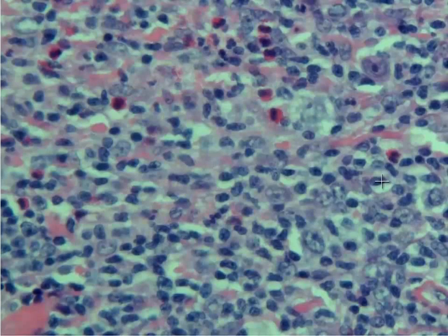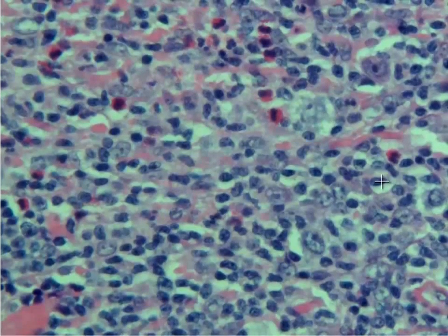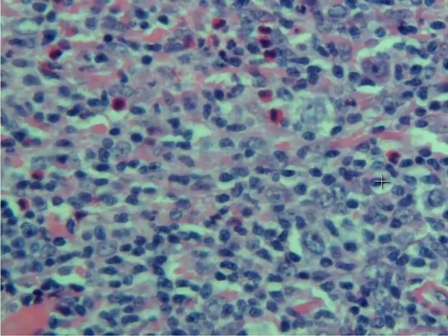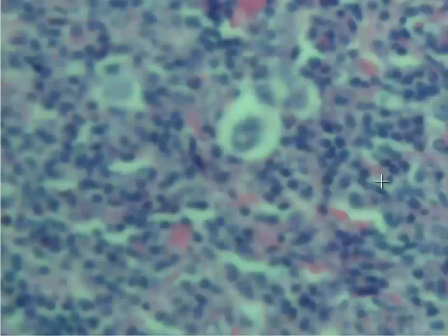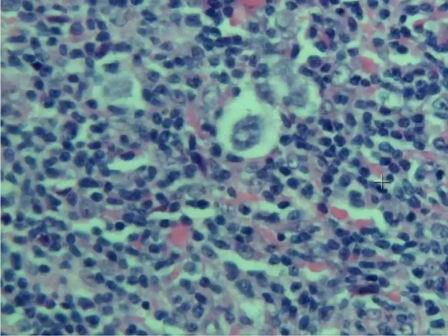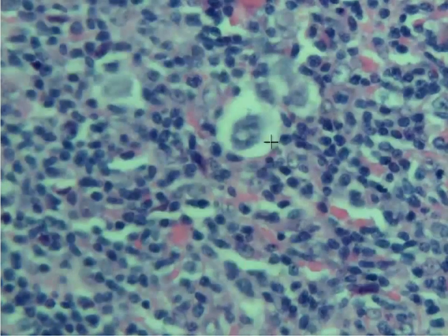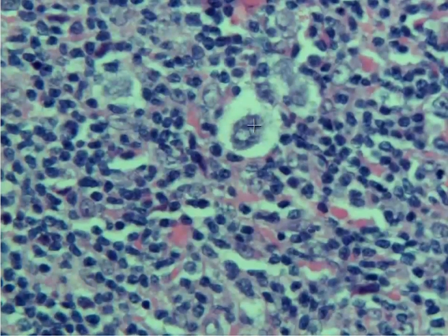Normally Reed-Sternberg cells have either two nuclei or more than one nucleolus, and they commonly look like what we call owl's eyes. But often this is not the case. Here is another example of a big Reed-Sternberg cell sitting in a lacuna.